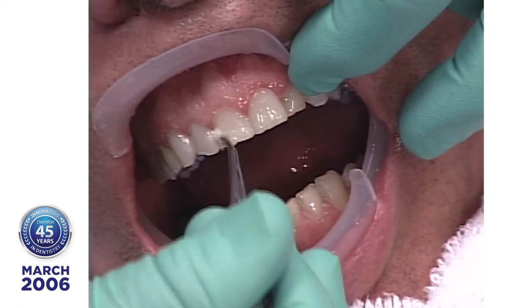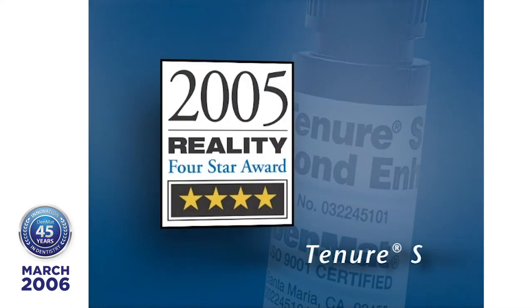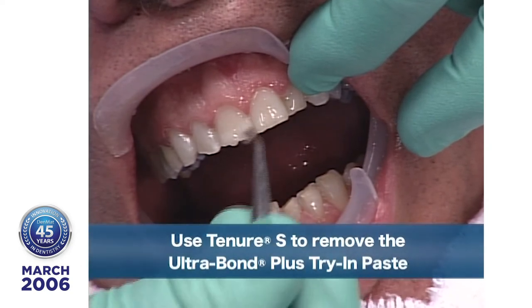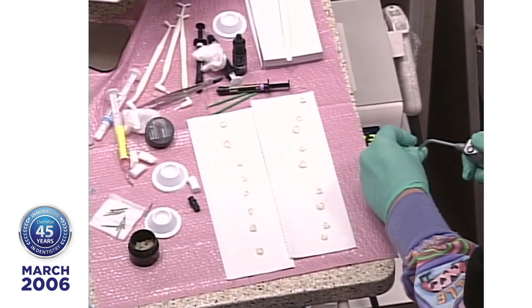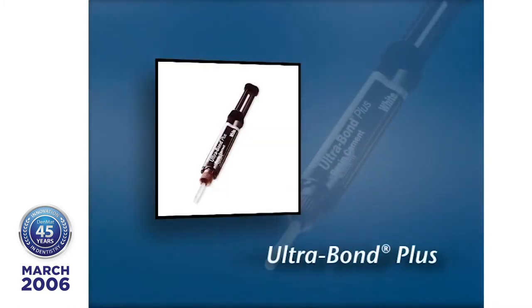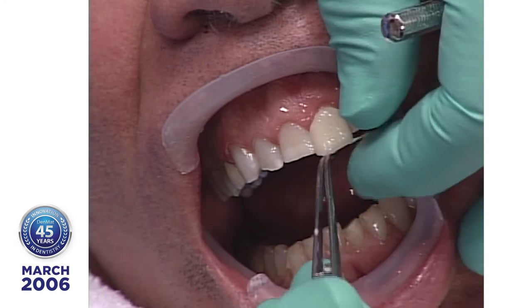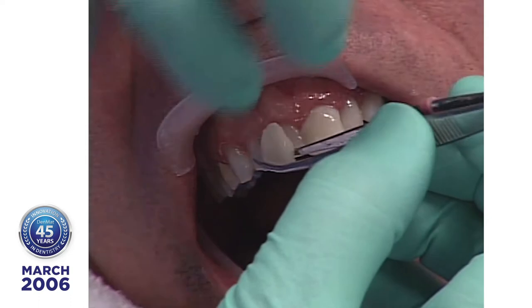And so I'm applying Tenure S to the surface because Tenure S will protect the surface from contamination. It'll also polymerize some of the try-in paste, so if I linger too long, I may not get the Lumineer to fit exactly right. Everything looks pretty good here. Central. Left central? Lisa always calls the name of the tooth out, and I repeat it. And I need the right one real quick. Right lateral? Okay.